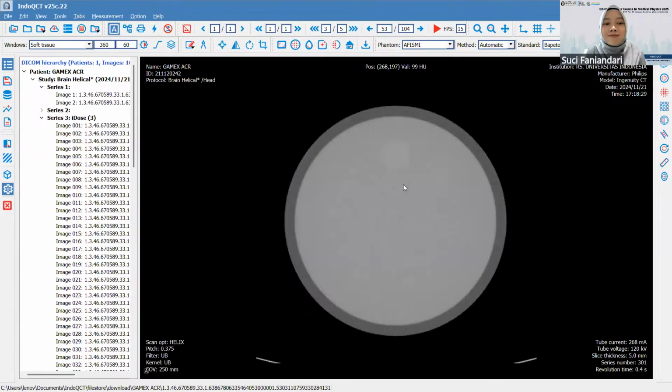Okay, any questions? Okay, thank you for the explanation, Mr. Arich. This is the question from Miss Nur Ain. Do I need to restart every time I open the Orthanc? No, once you have imported the modified JSON configuration, you have to restart once. Okay.